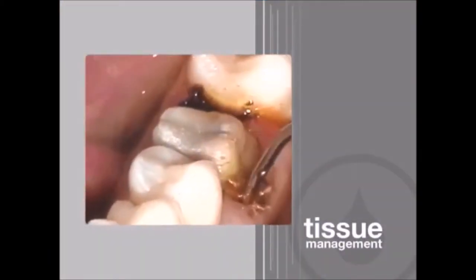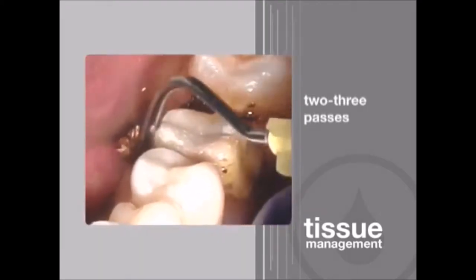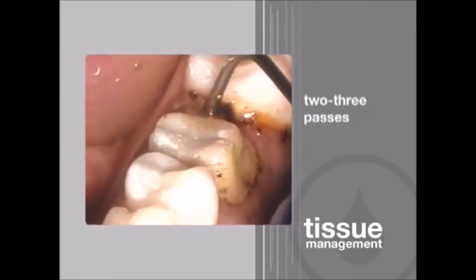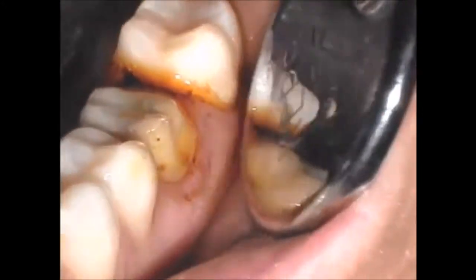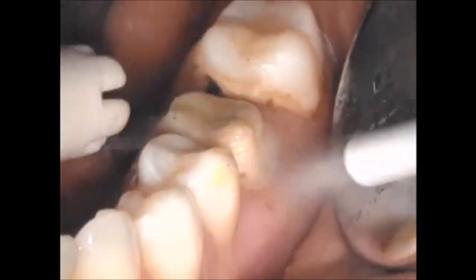Depending on the patient's periodontal and systemic health, hemostasis may be obtained in as little as 2 to 3 passes around the sulcus, or up to as many as 20 or 30. Hemostasis is realized when the new coagulum stops forming.